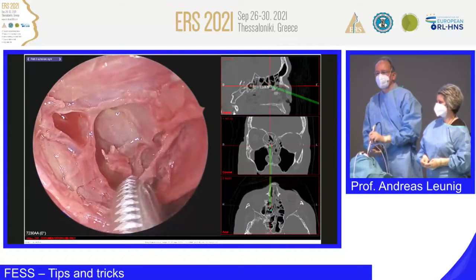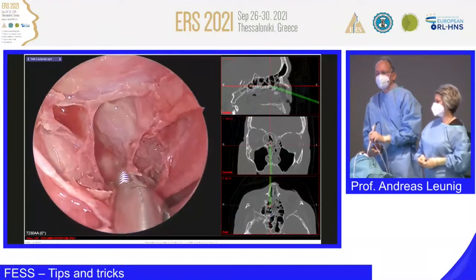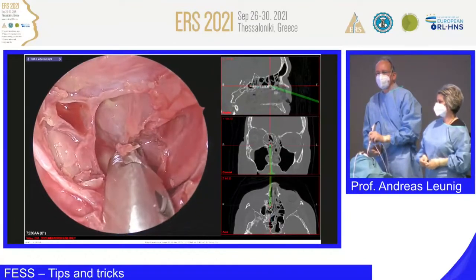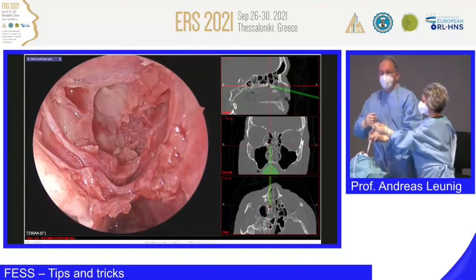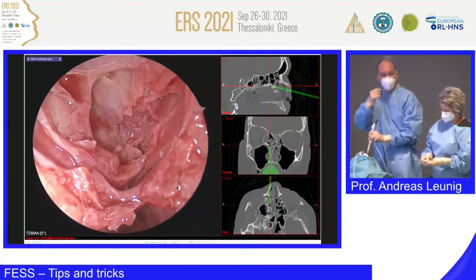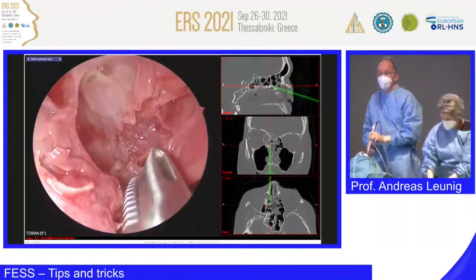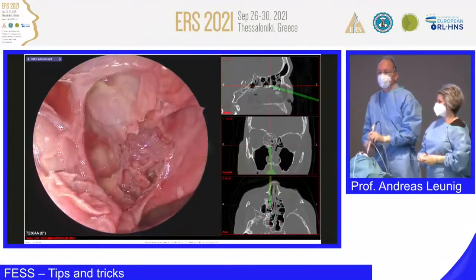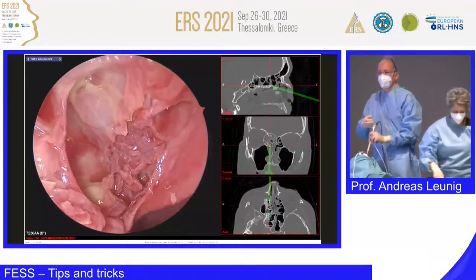And we will talk about this the next days in times of biologicals. I tell you, there will be a great change, but surgery will stay, and you are in the right place here. And you should learn exactly what Stammberger and Messerklinger published almost 40 years ago. Okay, the small round punch, please.